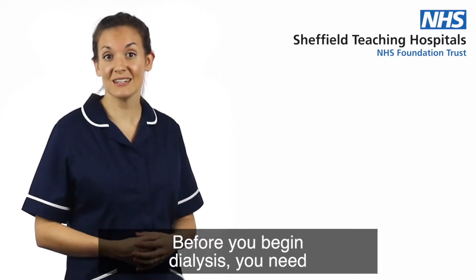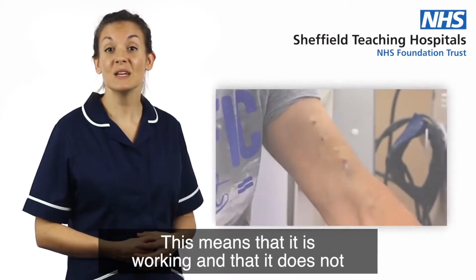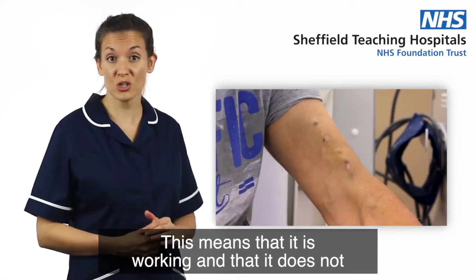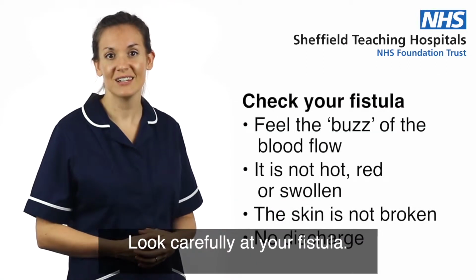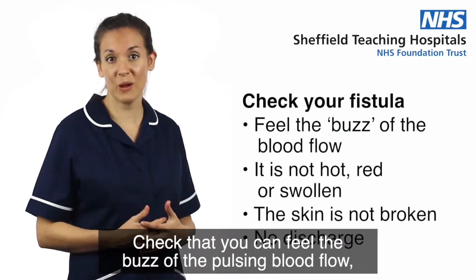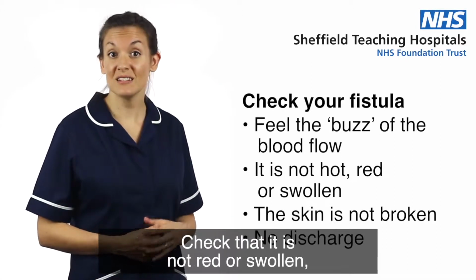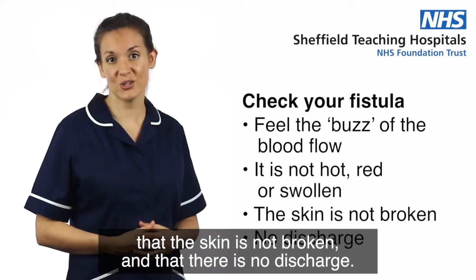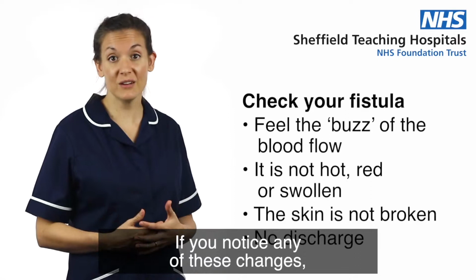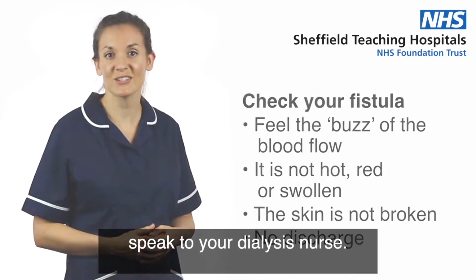Before you begin dialysis, you need to ensure that your fistula is safe to use. This means that it is working and that it does not show any signs of infection. Look carefully at your fistula. Check that you can feel the buzz of the pulsing blood flow and that it is not hotter than normal. Check that it is not red or swollen, that the skin is not broken, and that there is no discharge. If you notice any of these changes, there may be an infection and you should speak to your dialysis nurse.